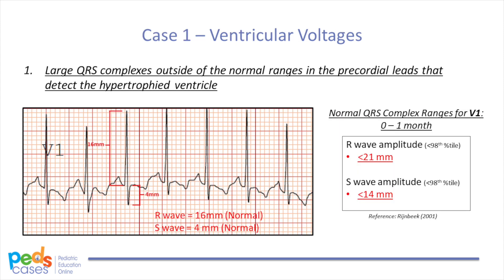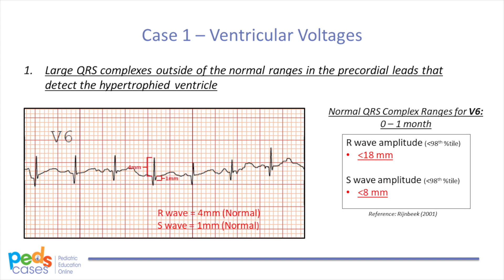Let's look at the ventricular voltages to determine if hypertrophy is present in our case. We measure the R and S-waves in leads V1 and V6 and compare them to normative data for age. Lead V1 represents the right ventricle and lead V6 represents the left ventricle. In our case, lead V1 shows an R-wave of 16 mm and an S-wave of 4 mm — both within normal limits for age. Lead V6 shows an R-wave of 4 mm and an S-wave of 1 mm, which is also within normal limits. Therefore, the magnitude of forces in the right ventricle are higher than in the left, and all values are within normal ranges.